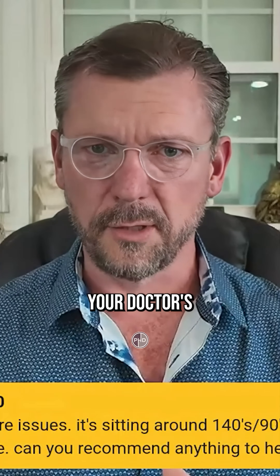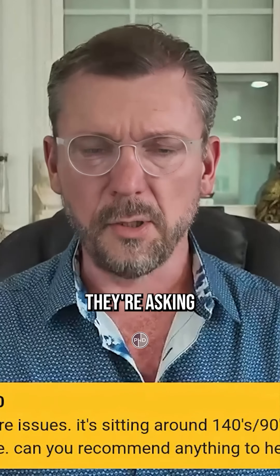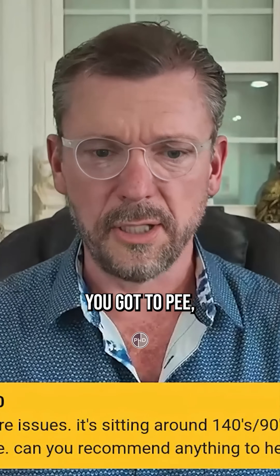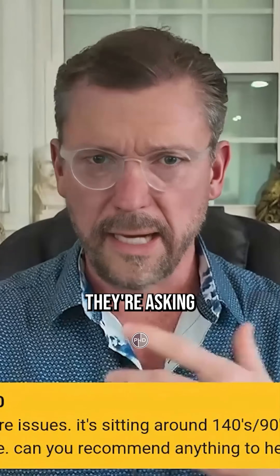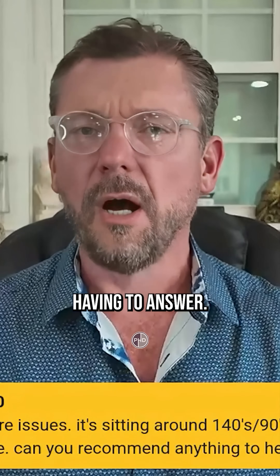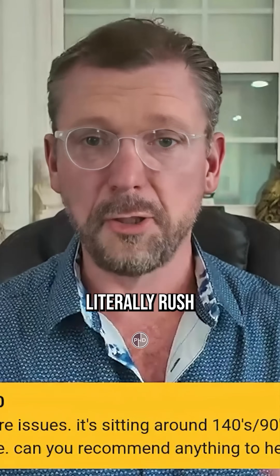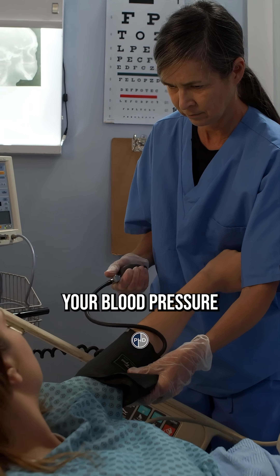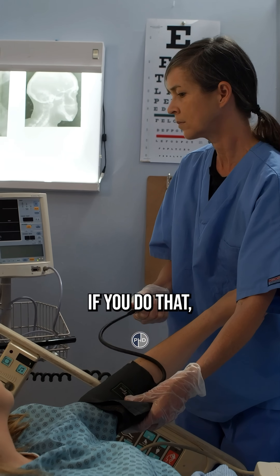So when you run into your doctor's office running late, they hurry you back, sit you down, and they're asking you questions while they check your blood pressure. You've got to pee but they didn't let you go. Your legs are crossed or dangling. All those things make your blood pressure falsely high, and they literally rush you back and check it immediately.